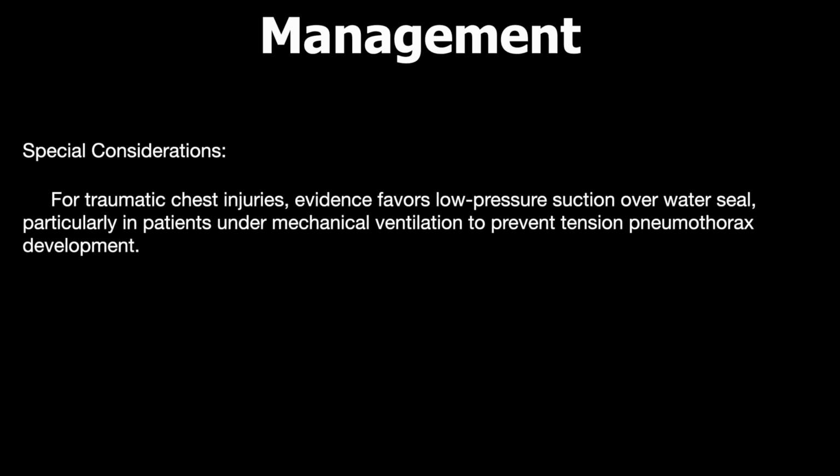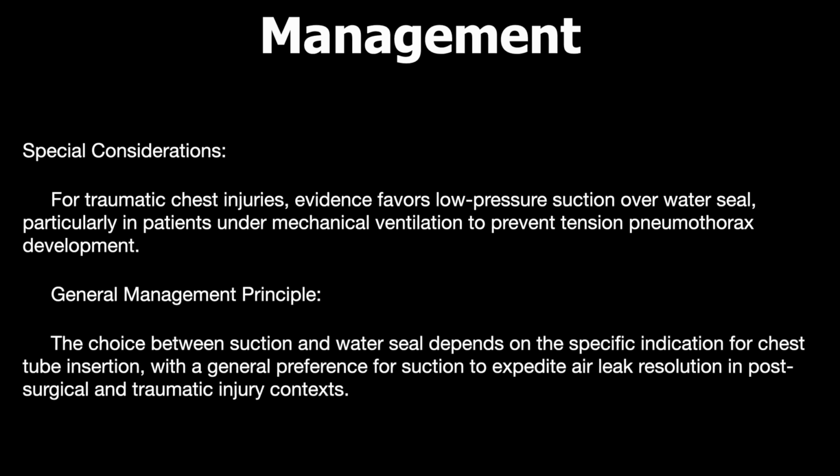Now, regarding the special consideration that you must keep for traumatic chest injuries, evidence favors low pressure suction over water seal, particularly in patients under mechanical ventilation, to prevent a tension pneumothorax developing. General management principle: the choice between suction and water seal depends on the specific indication of the chest tube, and there is a general preference for suction to expedite air leak resolution in the post-surgical and traumatic injury context.